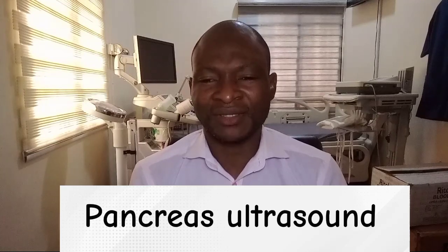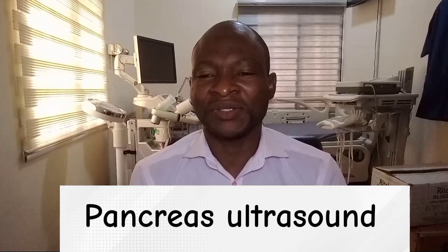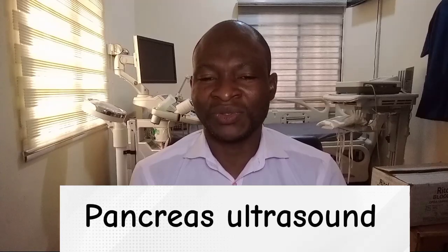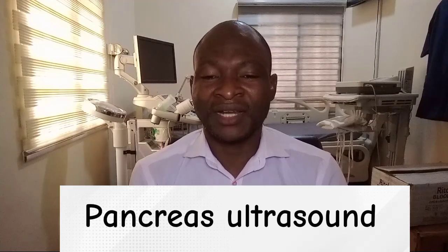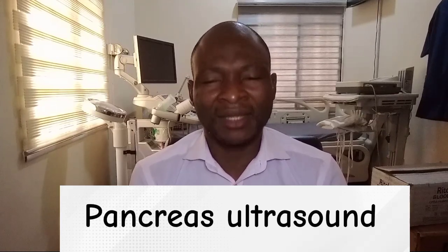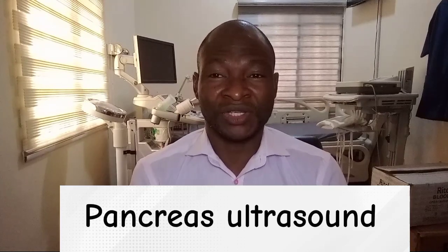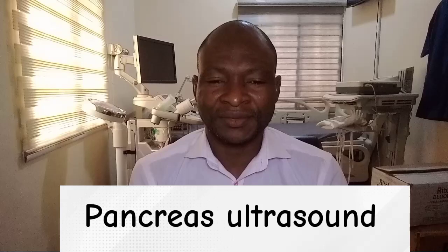In the obese patient, the pancreas is also very echogenic because the pancreas has no capsule, and the retroperitoneal fat may infiltrate the gland, resulting in a more echogenic pancreas. That's actually the reason why obese patients will have echogenic pancreas.